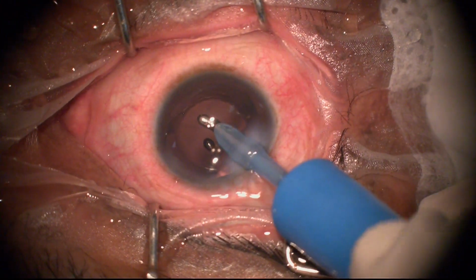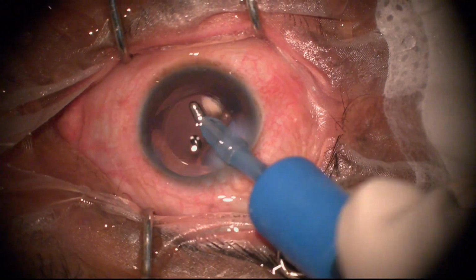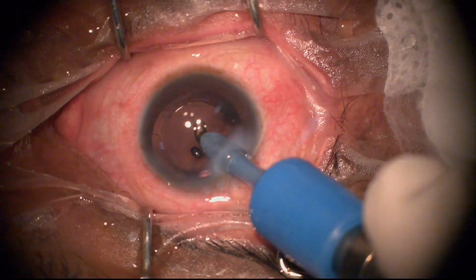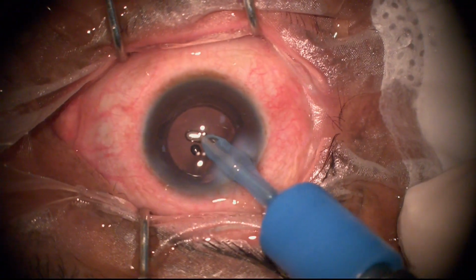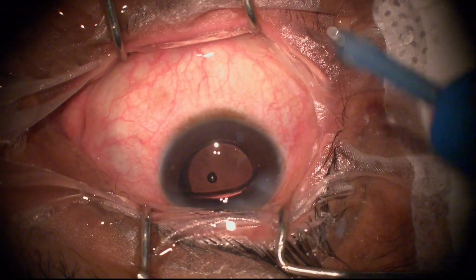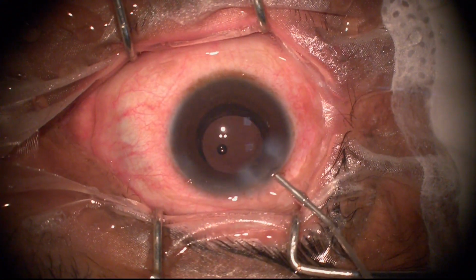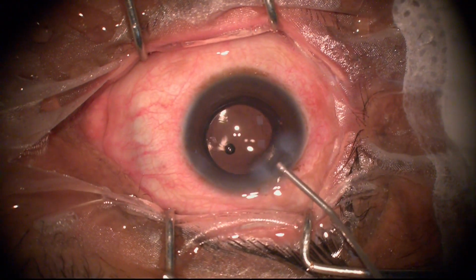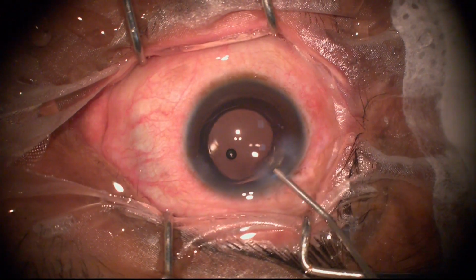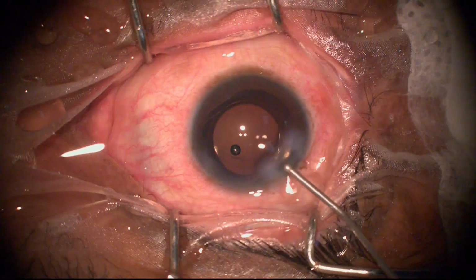So do you think we washed the anterior chamber for adequate time, or less or more? Even then you see there is still some visco there. Now, this is so annoying. You spend a whole 1 minute flushing it and then when you go inside you find there's still some left. Now, the chamber is also leaking. So when you have a leaking chamber like that, first thing you do is you hydrate the incision. You can hydrate one side.